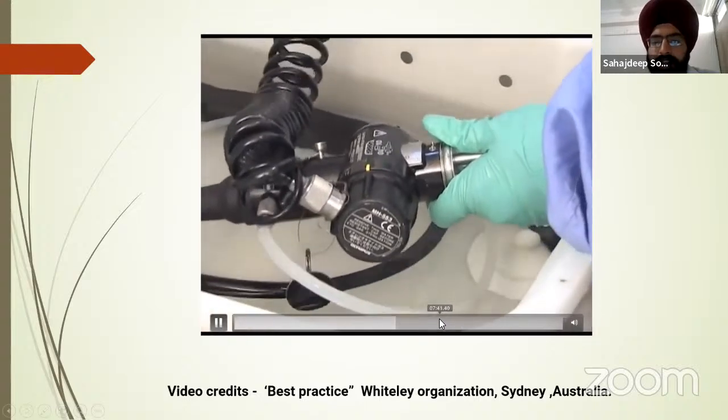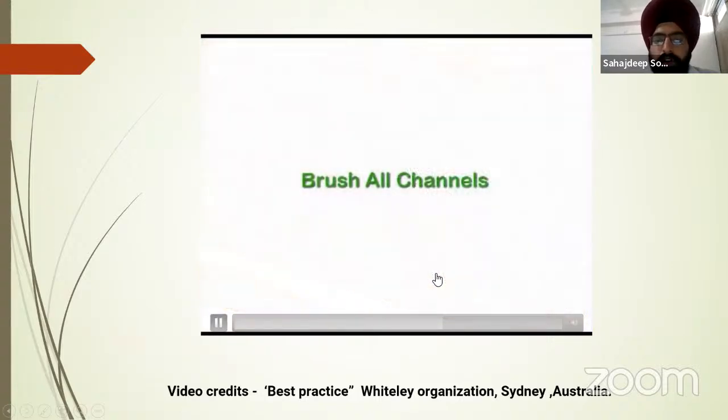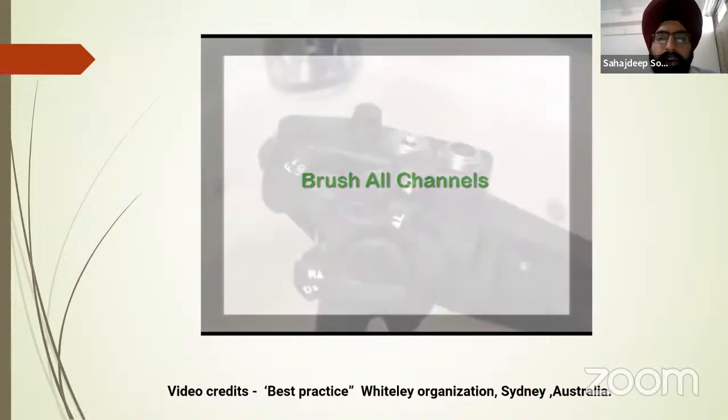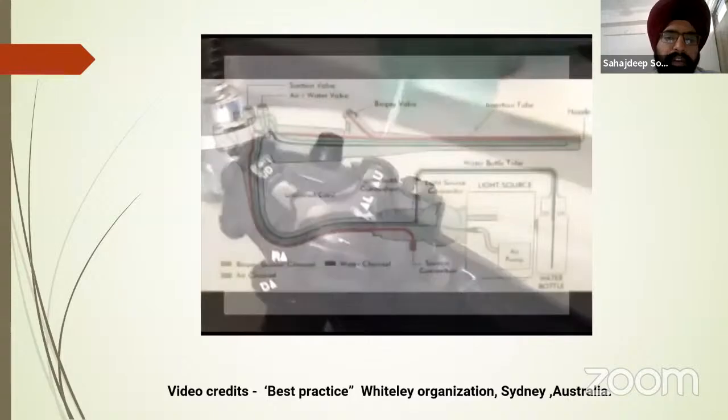Then the next important point is brushing. Brushing of all the channels. This is a very important point. The brushing is done with the long brushes which are available with every instrument.